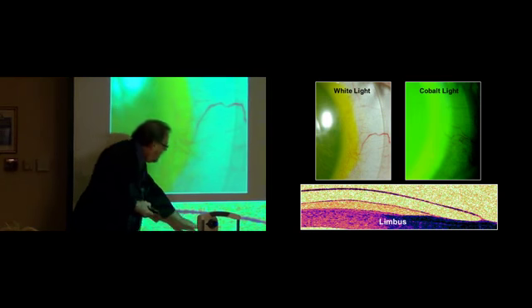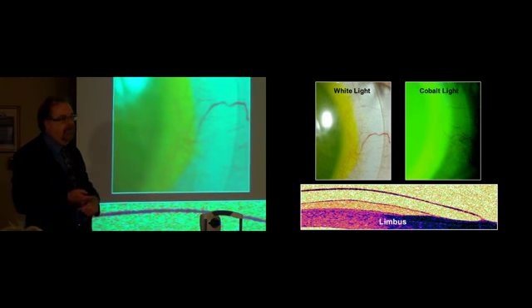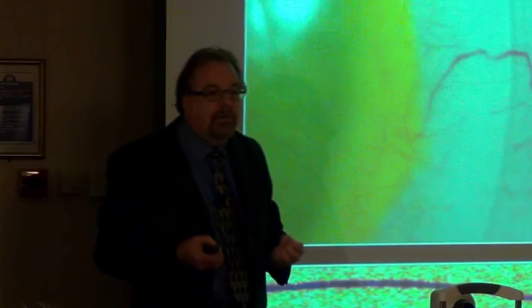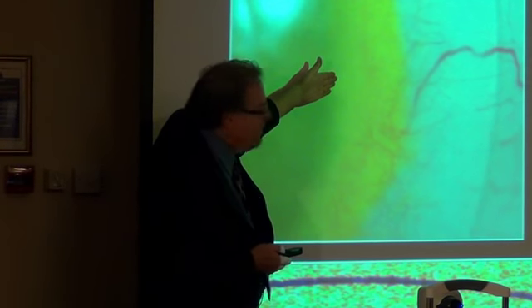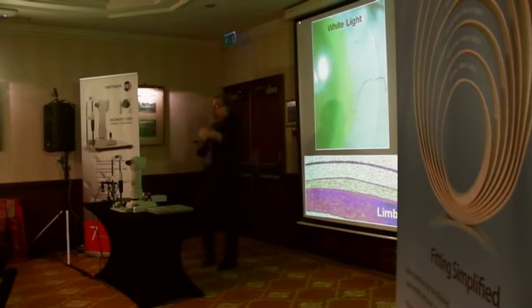What that tells us is that we indeed have clearance in that area of the contact lens. We can see it best, believe it or not, with fluorescein and white light, because now we can make out the boundaries of the cornea and how that fluorescein is going to bleed over.